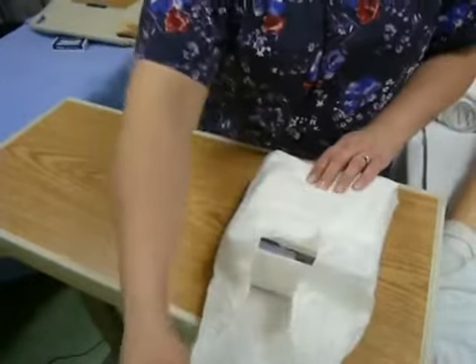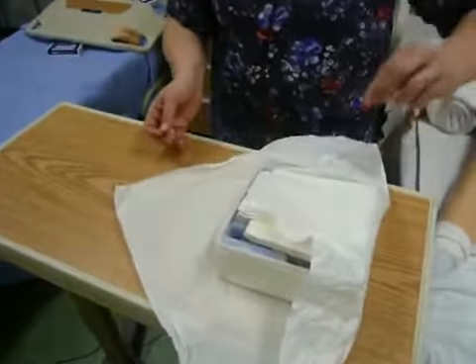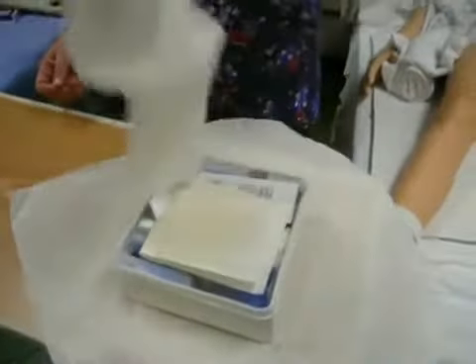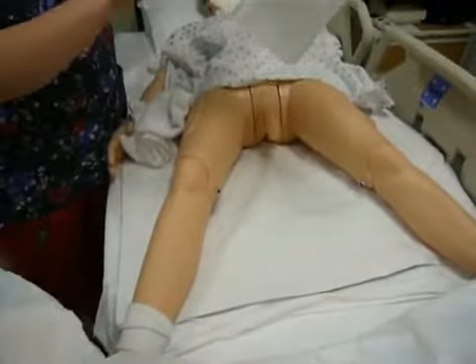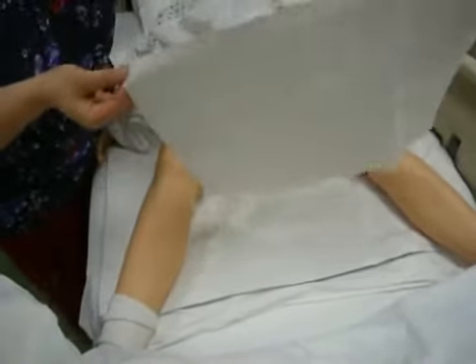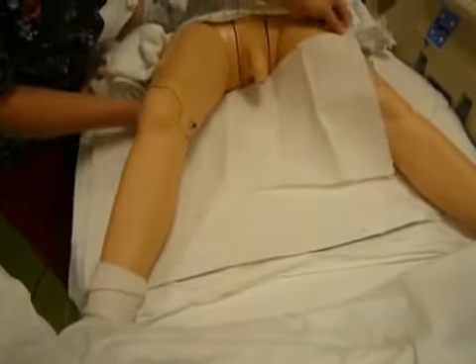The first flap always goes away from me. After that, I walk it around to make sure that I don't cross over my sterile field. Now, the first strip that's in here, I'm going to reach over, pull it up and out, and bring it to my patient, making sure that I know that I can walk around the edges because I have a 1-inch sterile margin, or contaminated margin, excuse me, and I'm going to slide it under so that I have another little mini sterile field to work with.